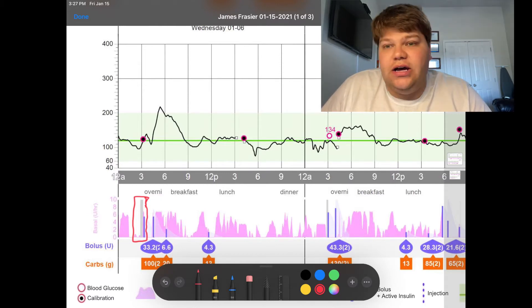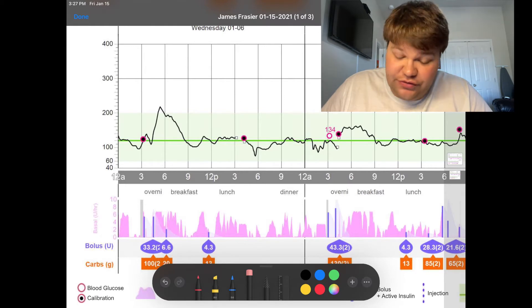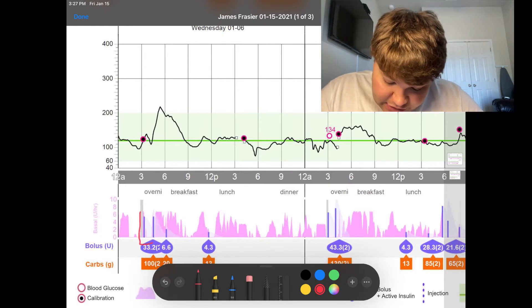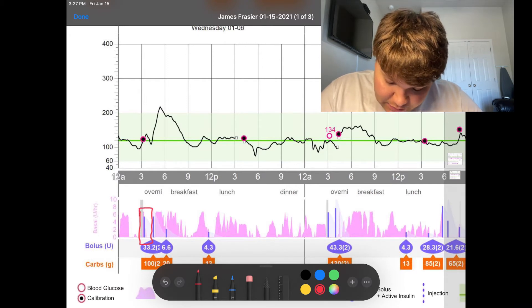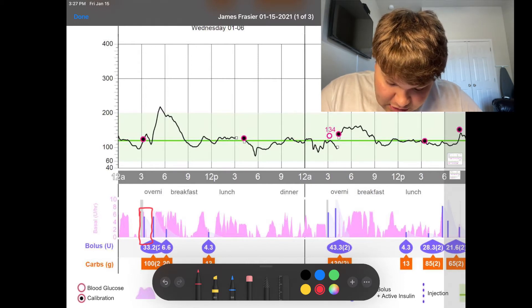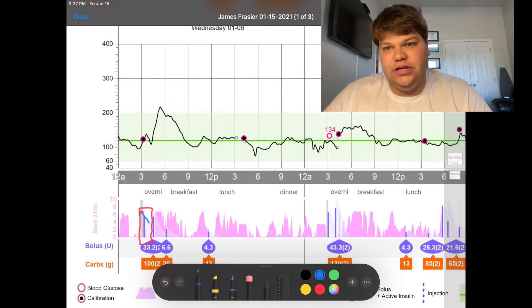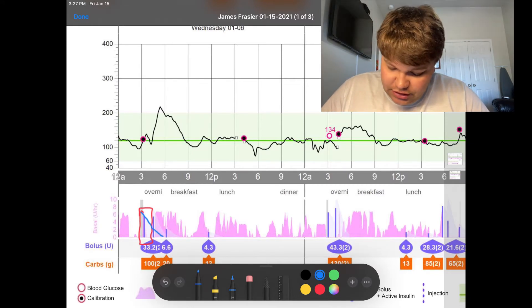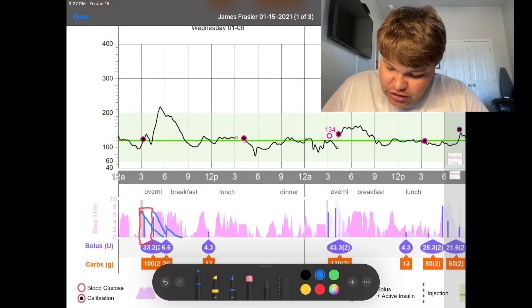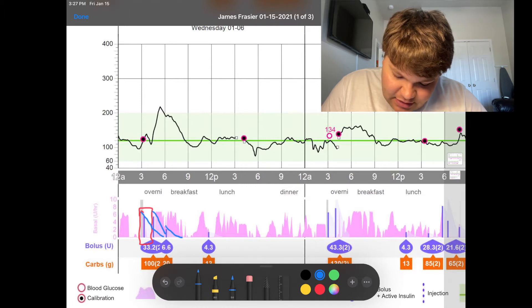You guys can now see that on my way to work, I don't get the full hour that I intend to. You can see what I'm talking about with an adverse effect of that on my blood glucose. I'm going to mark it in blue — this faint little image — and it runs down like this. Then another one here and another one here. These three little lines descending that I'm showing you is how your pump is calculating your active insulin. After that first pre-bolus, if you look there, there's nothing in this area from auto mode.